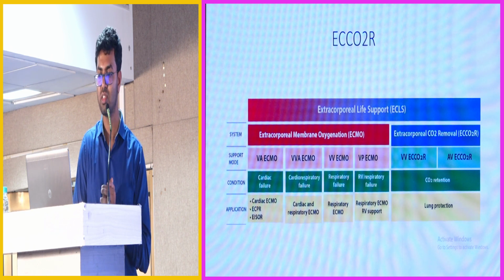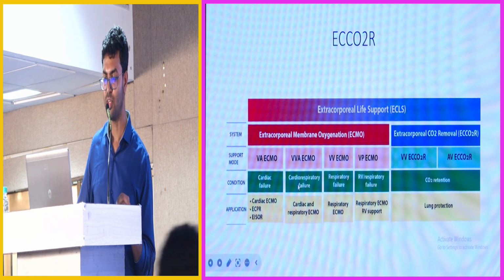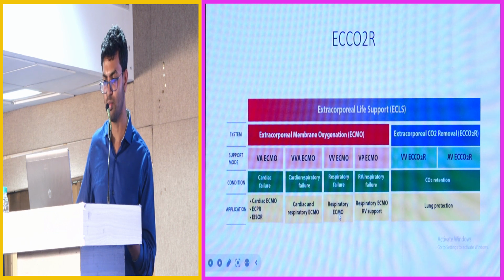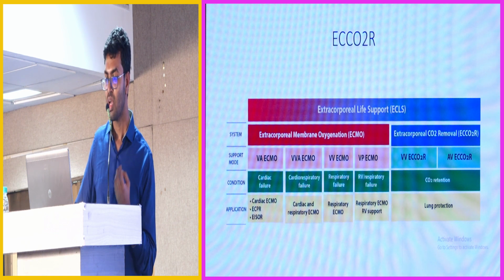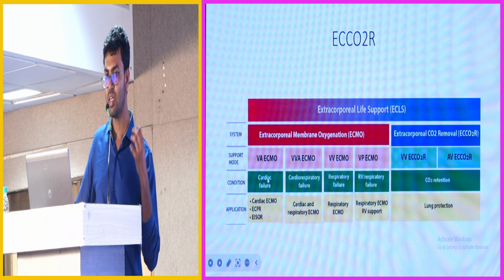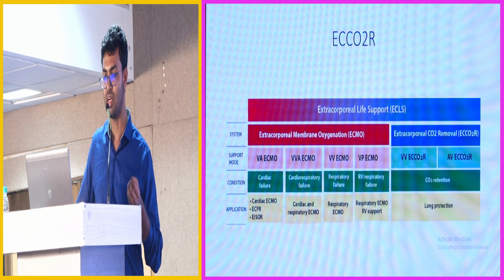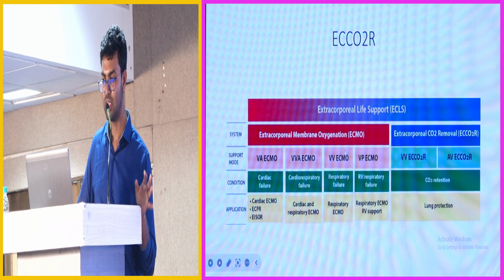So that concludes extracorporeal membrane oxygenation, where I have told you how you have to manage a VV ECMO patient, how respiratory failure, how we start an ECMO, and then VV ECMO, how we converted that VV ECMO to veno pulmonary ECMO, and how we placed a VA ECMO in a heart failure patient, and ECPR I have told you, and how we converted that VA ECMO to VVA ECMO, where we have taken a side limb to the right atrium. So this concludes our extracorporeal membrane oxygenator therapies.